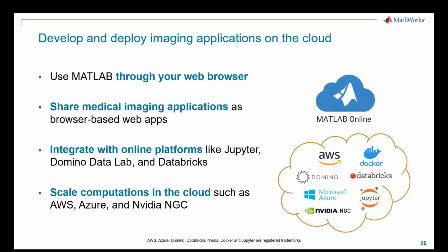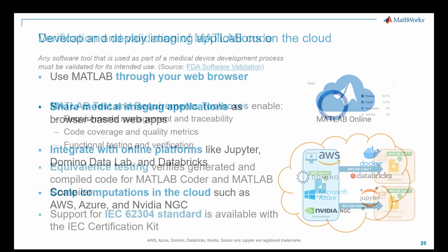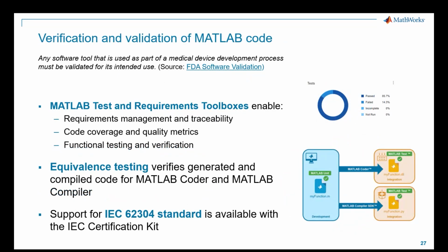Also, you can deploy your analysis through your web browser using MATLAB Online, integrating with platforms like Jupyter and Databricks. And you can scale up your computations in the cloud to run in environments like AWS, Azure, or NVIDIA NGC. When you're done creating your applications, you may need to verify and validate them, and to ensure that your deployed code matches your MATLAB code. We have tools that facilitate testing your code against your requirements, and you can even validate it to ensure that it meets IEC 62304 standards for incorporation into medical devices.